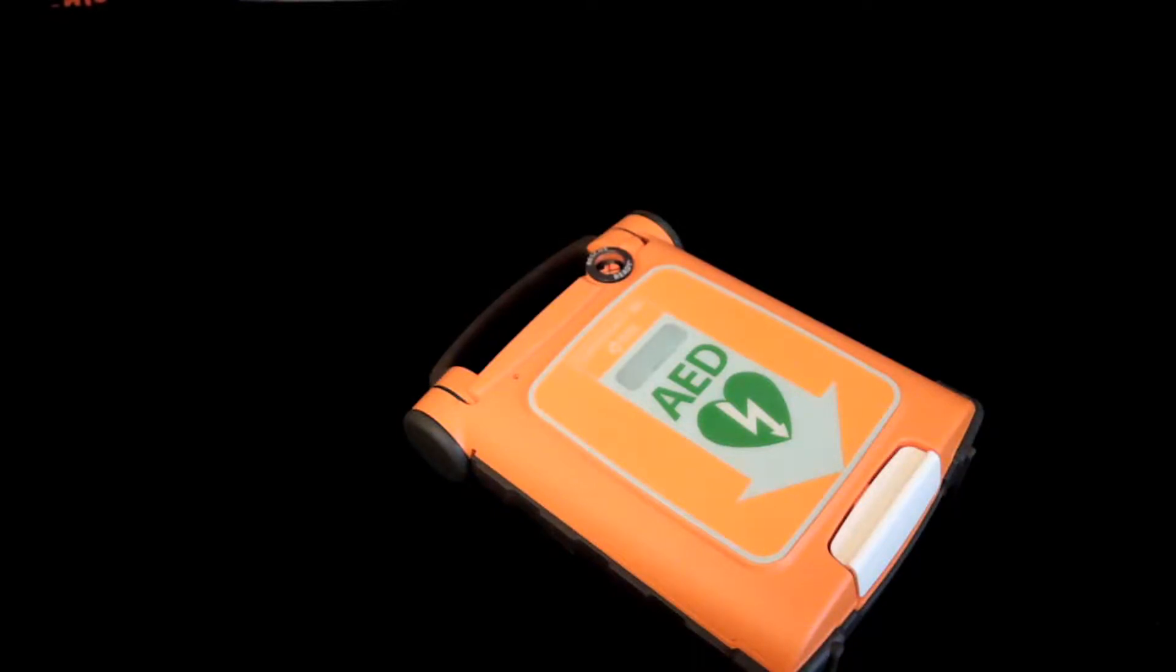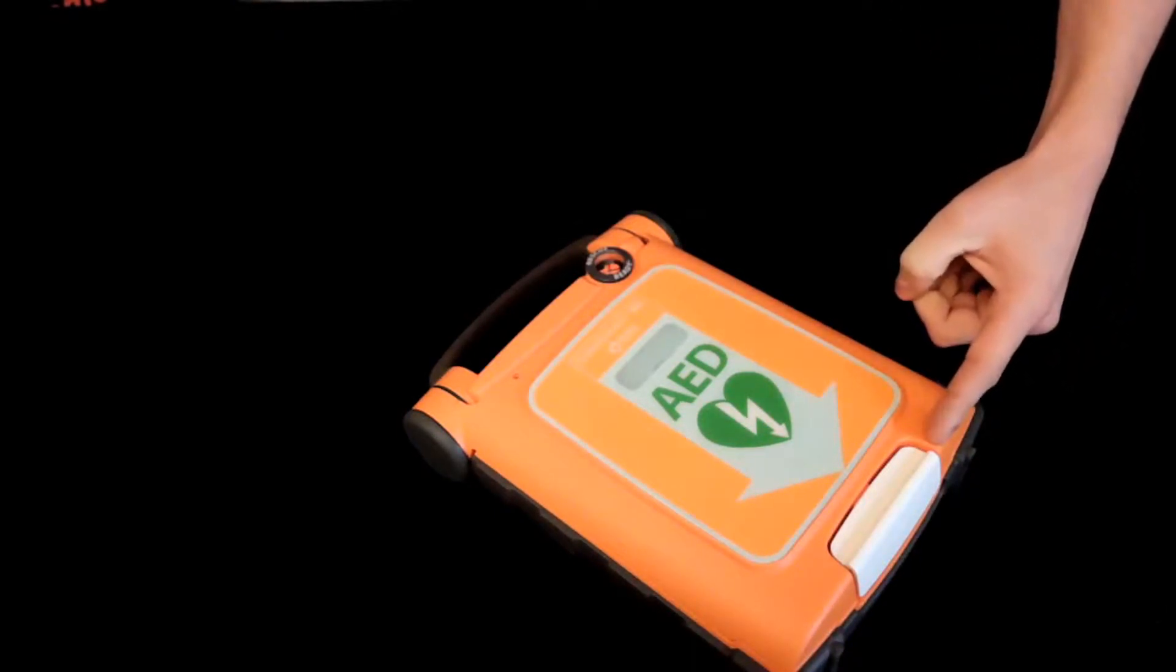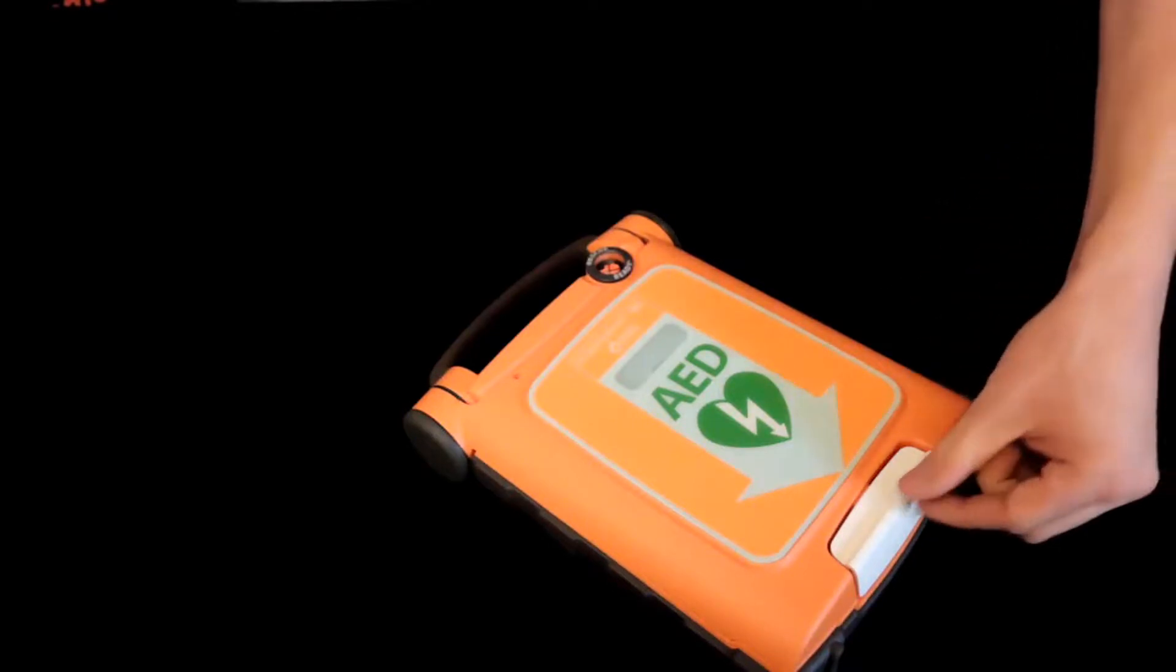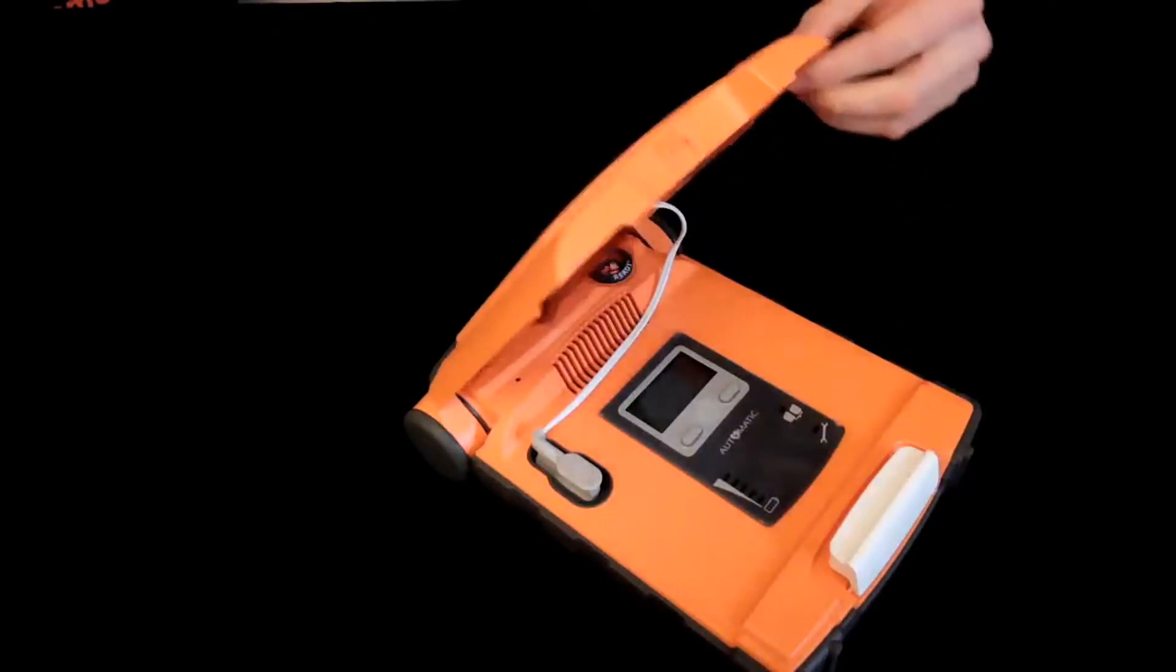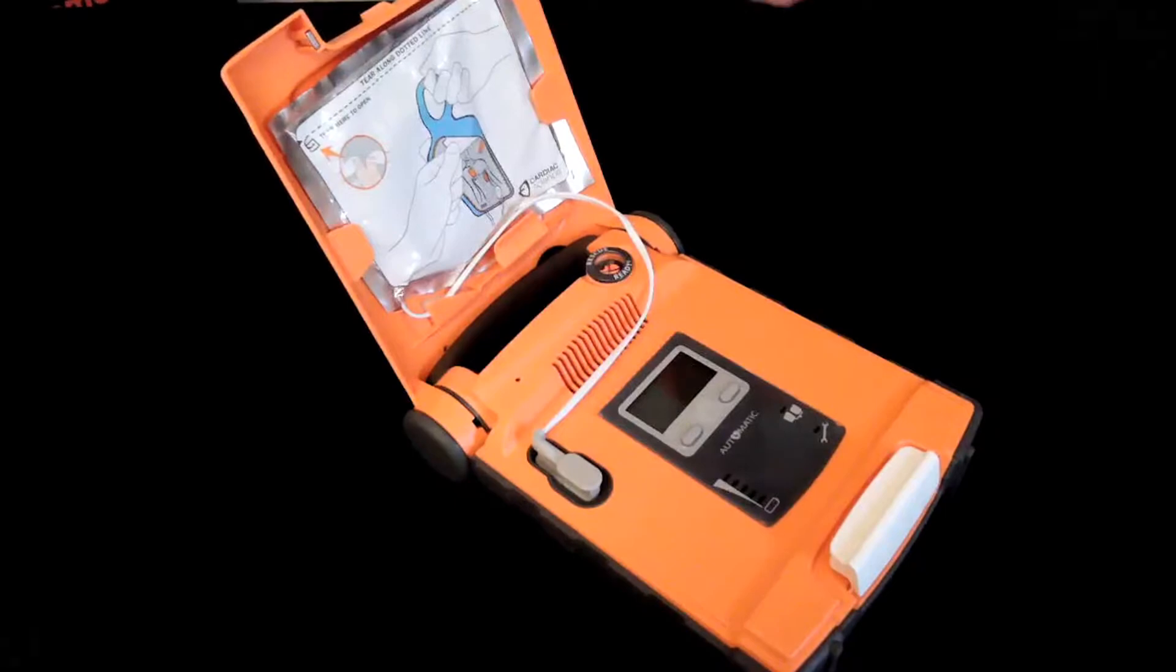Begin by pressing the white lever on the bottom of the AED to open the lid. The AED may begin speaking to you, so you can ignore the prompts given while replacing the pads.